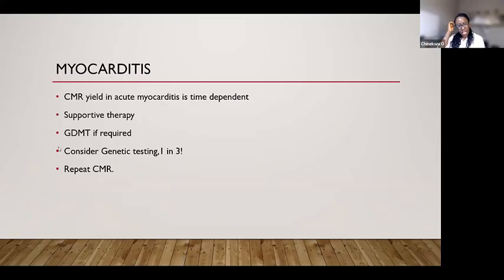Now, the benefit of cardiac MRI is that in the patient who has a substantial event, we could also repeat in 6 months' time, like we did for this gentleman, because his LV is not normal. We're supporting with guideline-directed medical therapy, offered him genetic testing, but we also want to see that his heart has recovered, so that if he hasn't, we can do other things.